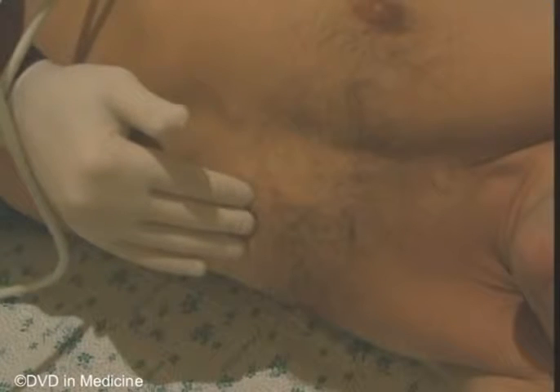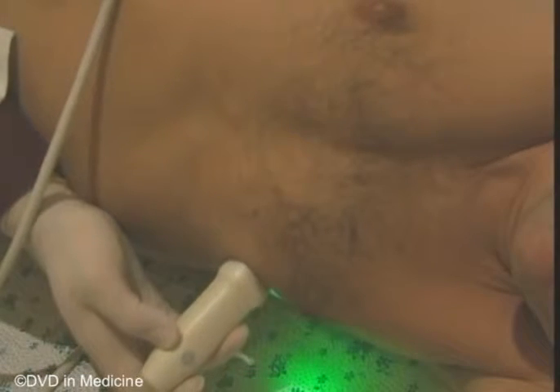Apical images. One should place the transducer in the area of the apex of the heart, and the scanning plane must be directed in such a way that one obtains the image of all 4 chambers of the heart.